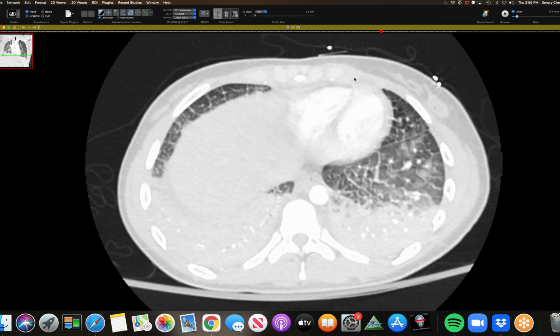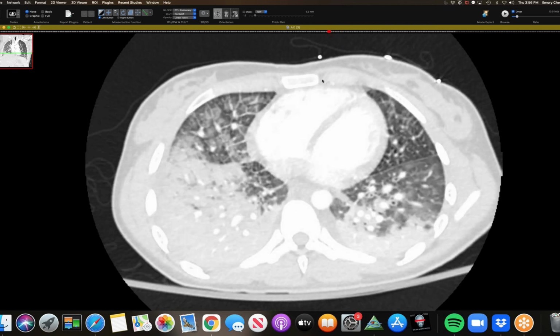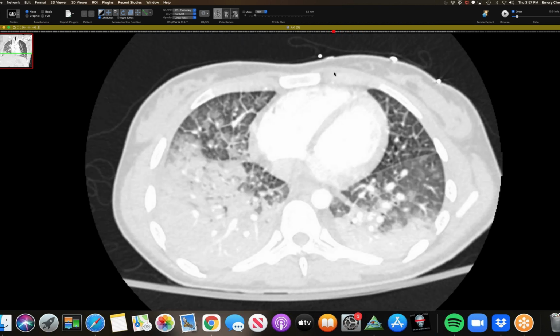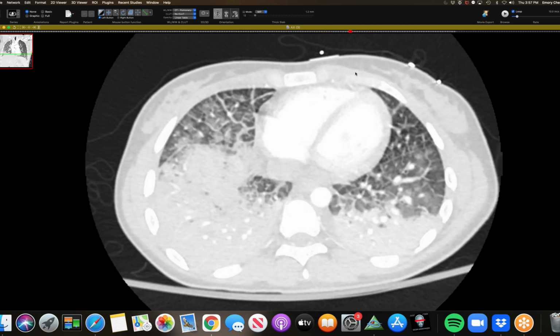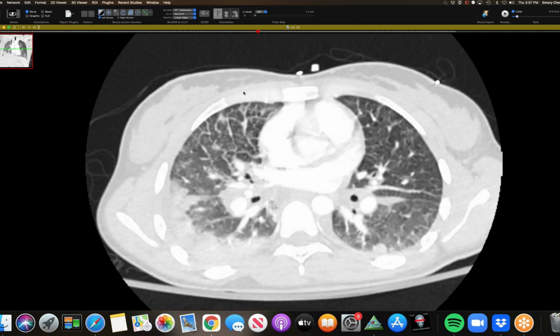And it seems like she did pretty well. This was from about a week and a half ago, and then she only had 1 or 2 follow-up X-rays. It seems like she did well after she was put on antibiotics and recovered well. She had good reserve also. No past medical history. 19 years old.